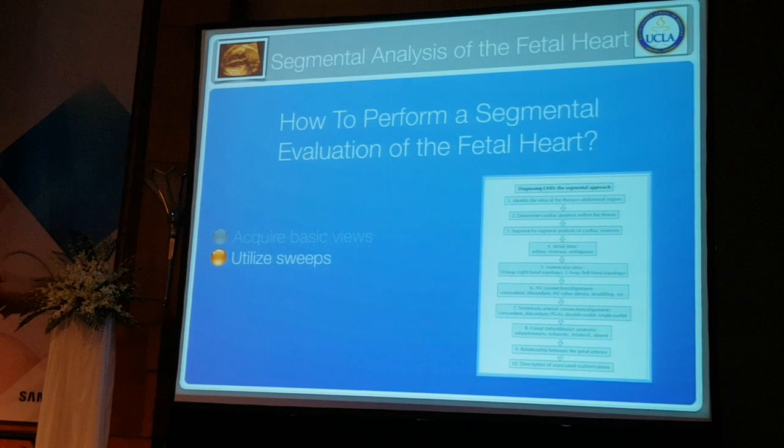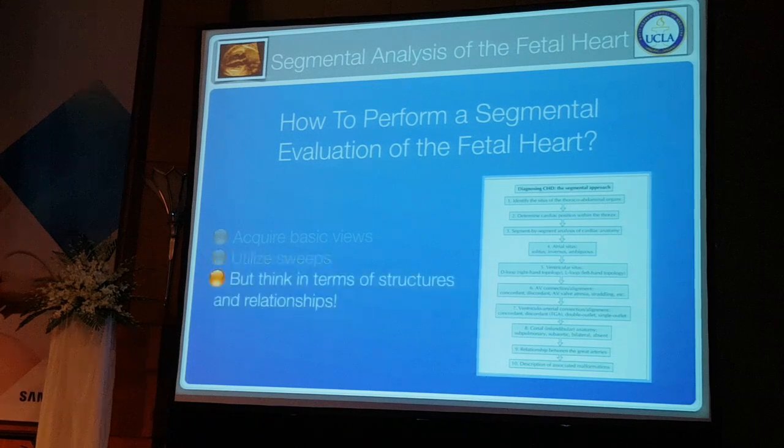You want to look at sweeps as well. You want to see how one part of the heart connects to the next part. And this is very important, and I've sort of been touching upon this already, but you should be thinking in terms of structures and relationships. So even though we're acquiring basic views, you want to be thinking in terms of structures and relationships.